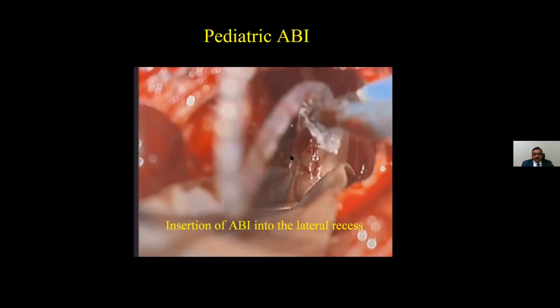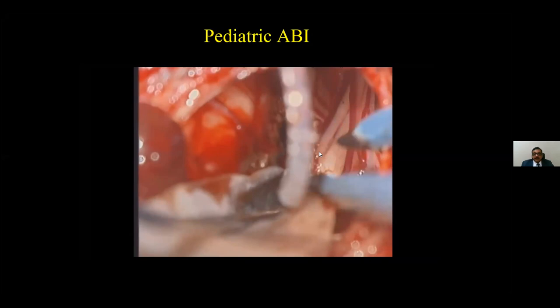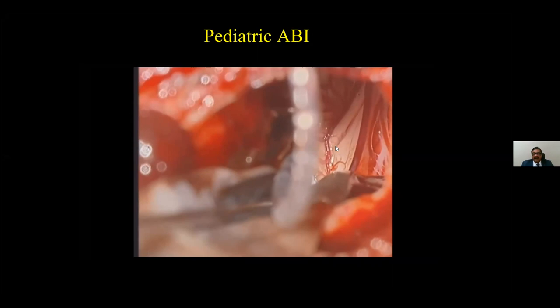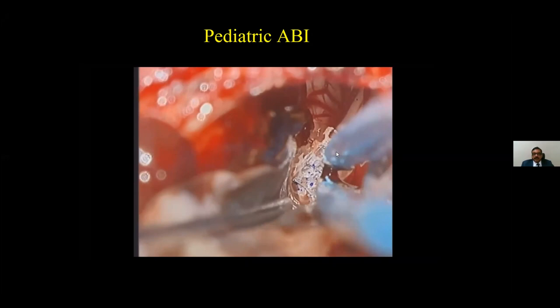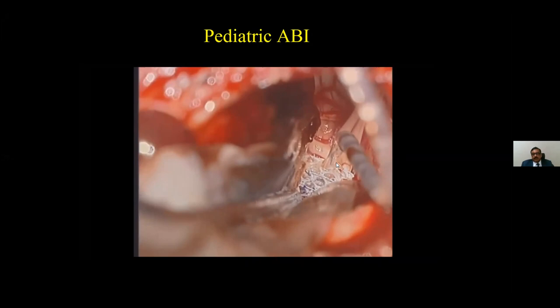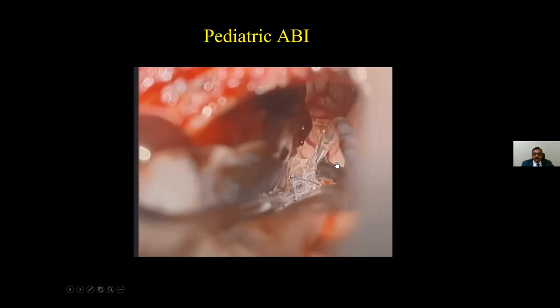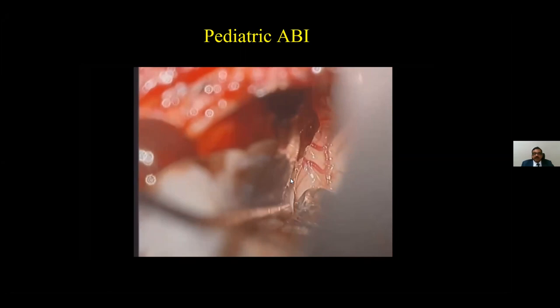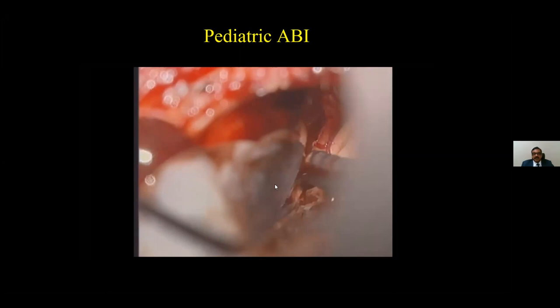So this is the ninth nerve which is being followed, and you can see the implant going in. It's made like a cochlear implant electrode, which is a long linear electrode. This is a flat electrode. The same cochlear implant principle, but it is made into a plate. And you can see each one of the circles is an electrode. And this is now gently pushed into the recess till the point of first resistance. So you gradually, very gently push it in as atraumatically as possible till you meet your first resistance. This is important because, as I told you in the beginning of the lecture, we want to access the dorsal pocket. So the deeper you go, the more chances are that you will be accessing the dorsal pocket.